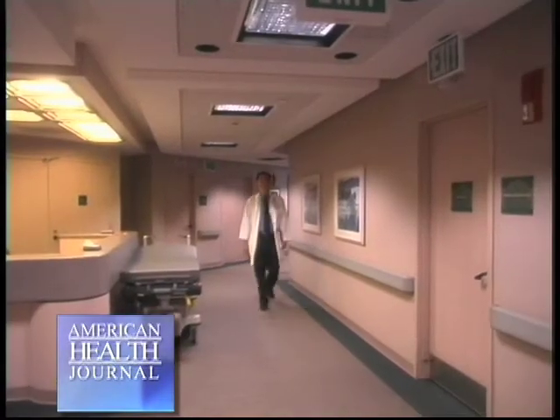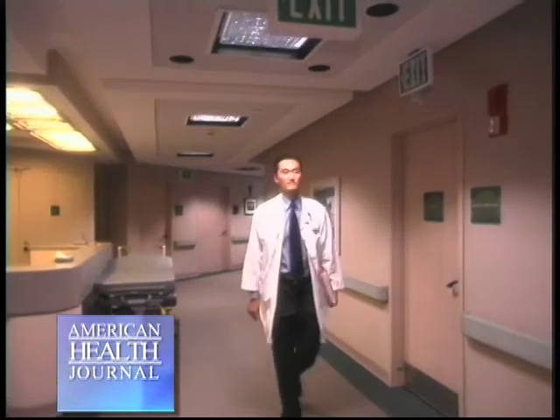And we use it for cancer patients. And really, the indications for cancer therapy is wide range. We treat the very common cancers, such as prostate cancer, in addition to the more unique cancers that we see, the rarities, special brain tumors. And we've also been able to use tomotherapy for retreatment in radiated patients who've had prior conventional radiation treatment who need more specialized therapy.